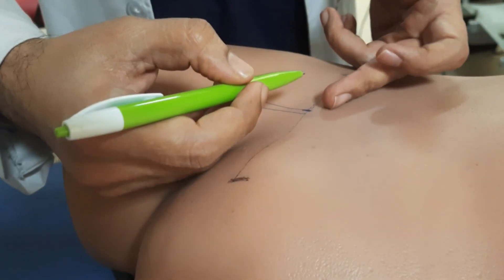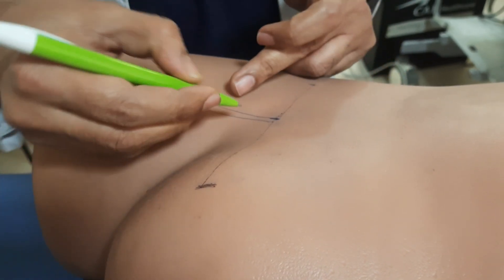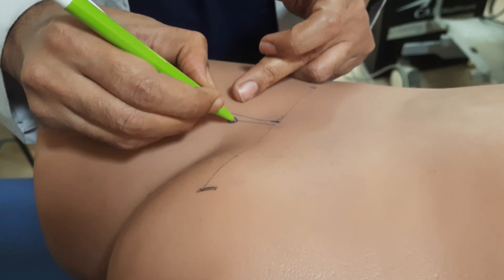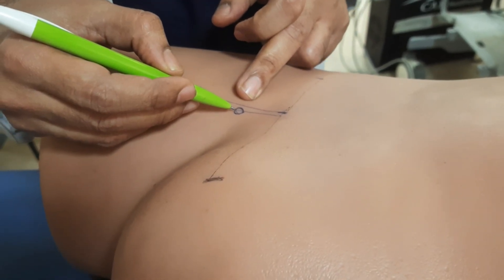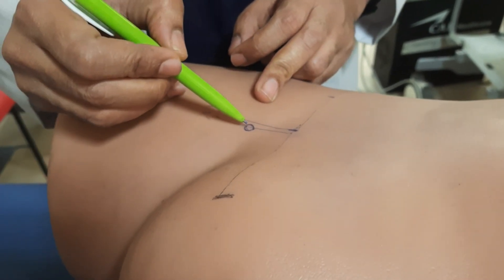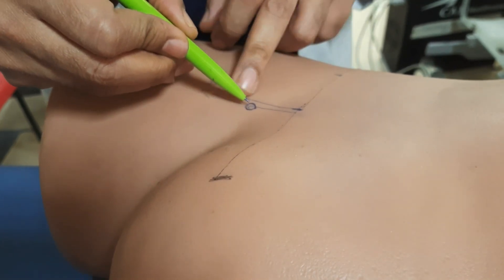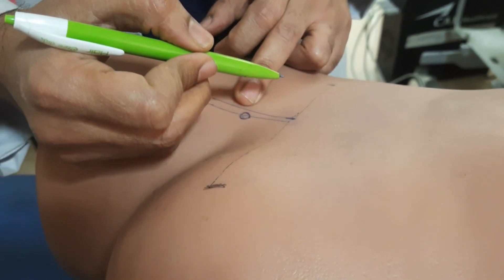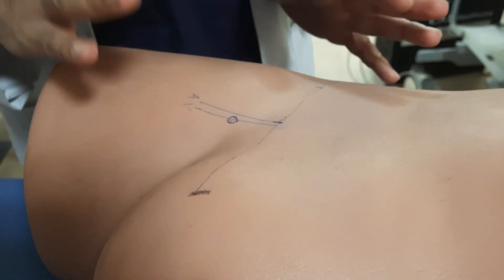Just three to four centimeters below the inguinal ligament, this is our puncture site — the site for central venous catheterization. We have to go at a 45-degree angle, like that. This is our needle at 45 degrees. Once we pierce one to two centimeters, we will find the femoral vein. So that is the surface anatomy.